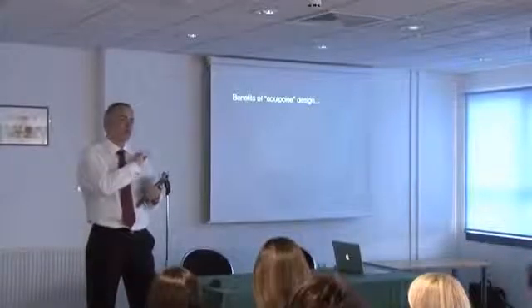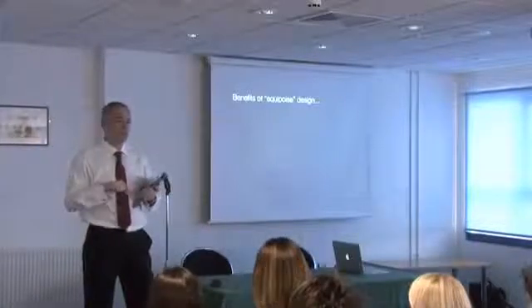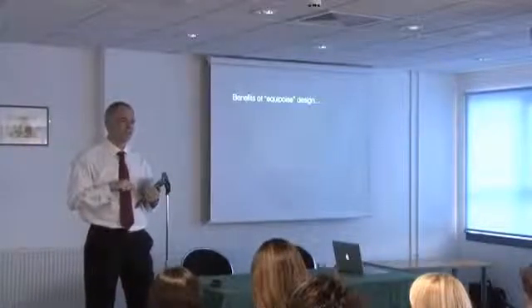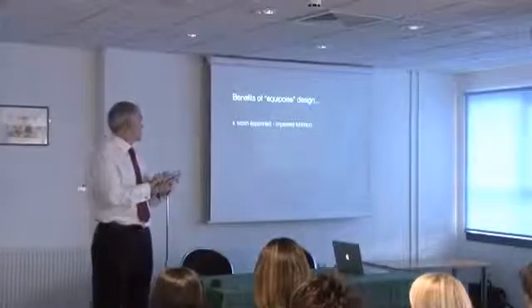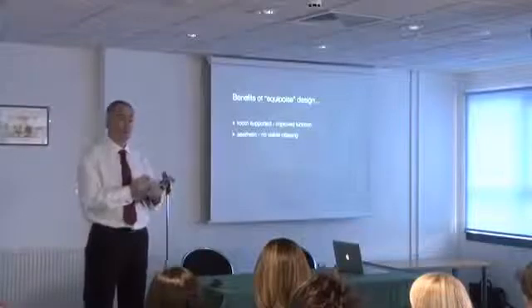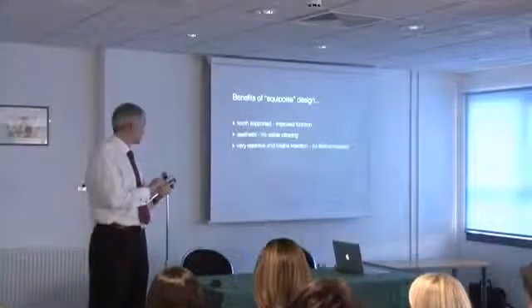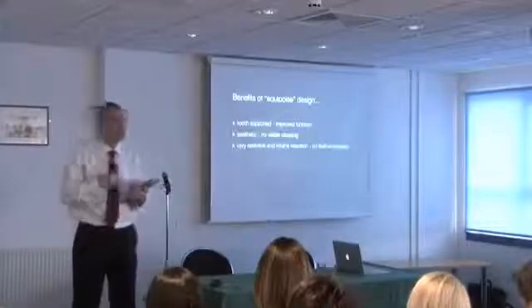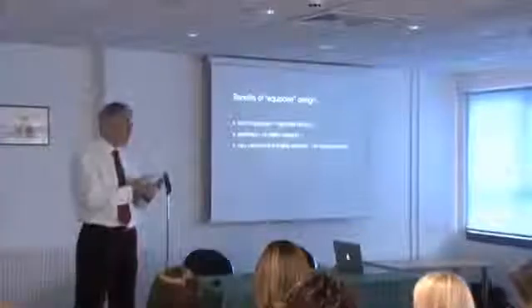Okay. More importantly, the day I fit that, she needed a friend to help her get it out, because these are so retentive. So it's a very interesting design. Benefits? It's tooth supported, so function's improved. It's aesthetic, no visible clasping. It's extremely retentive, and it's going to retain that retention. She'll come back in a year, it's still going to be retentive because of those guide planes.